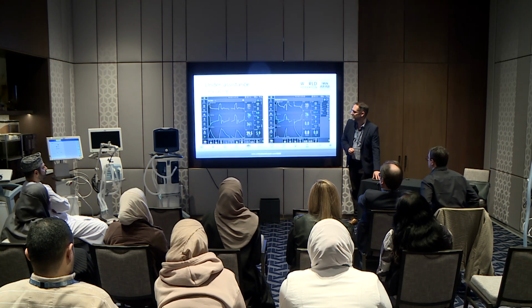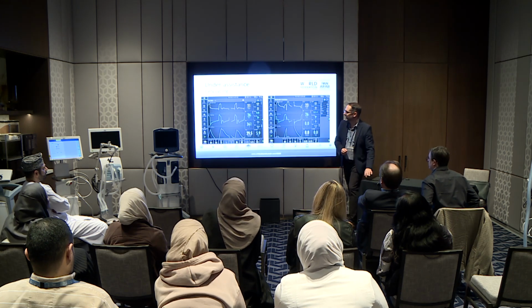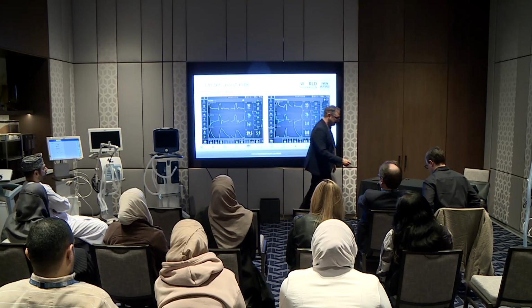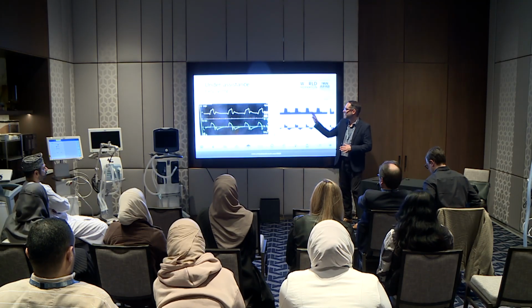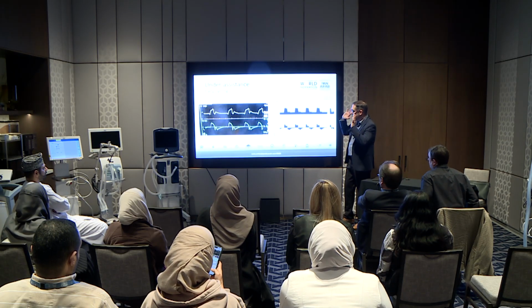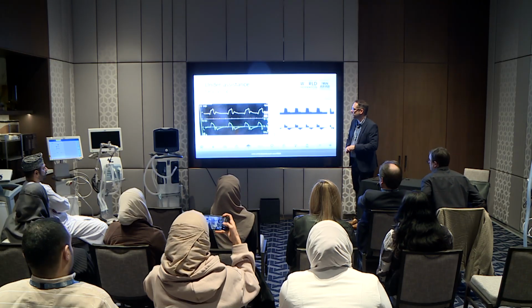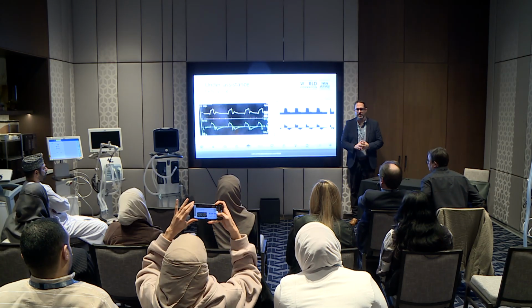That makes sense so far? Now, a little note about early cycling and this increase here. I mentioned before that you also see it in reverse triggering, right? So which one of these slides, we'll call this A and this one B, which one is reverse triggering, A or B?